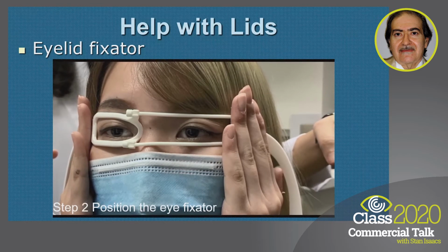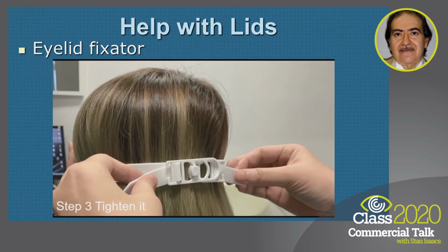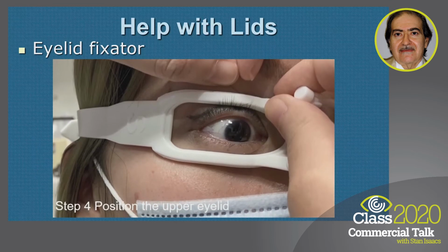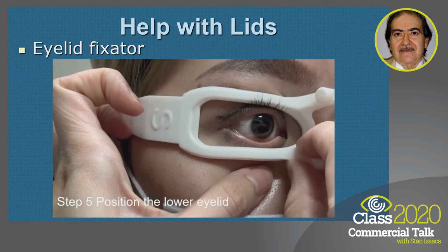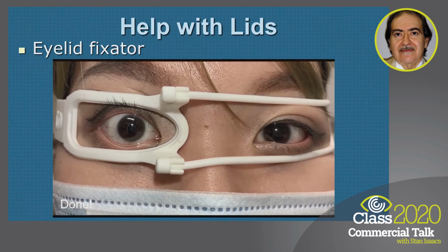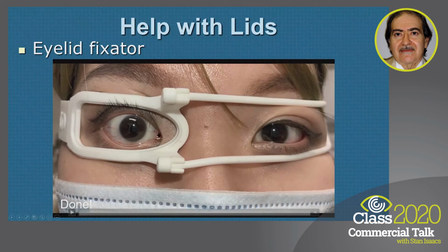You strap it fairly tightly behind the head, and once it's strapped and the patient sits comfortably in front of the machine, then you pull up the upper lid and pull down the lower lid, and the silicone holds the top and lower lid in position. So you can see the difference between one eye and the other eye. One eye is fully open and the other eye isn't. And this really helps you do a very, very good capture.